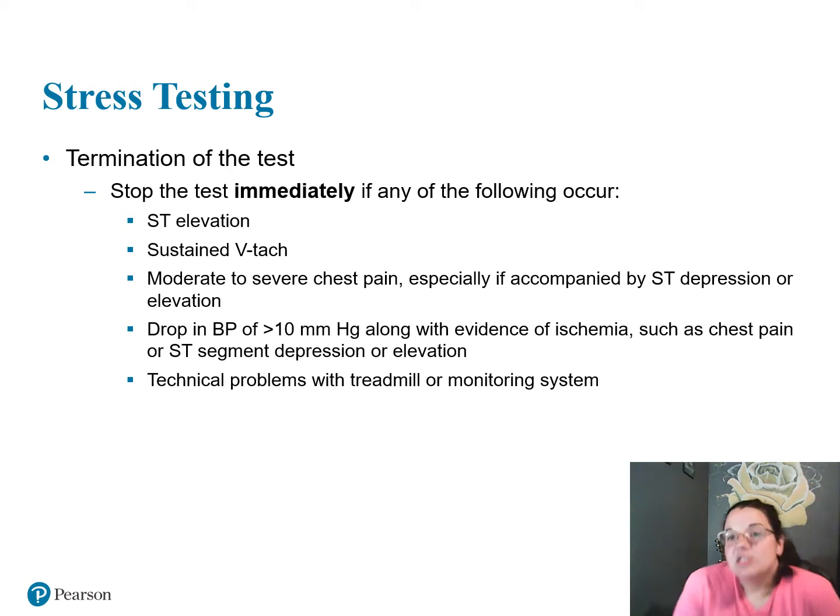All right. So now we know what stress testing is, why we do it, how it's done. Now we want to know, when do we stop it? When do we terminate the test? So here are the reasons why you would stop a test. If we see ST elevation, so remember in chapter 13 and 14, and I believe it was in chapter 14, we discussed ST elevation. What is that a sign of? A heart attack. Remember your 3 I's: ischemic, injury, and infarction, right? So if we're seeing any form of an ST elevation, we are to immediately terminate the stress test. In other words, stop the test.